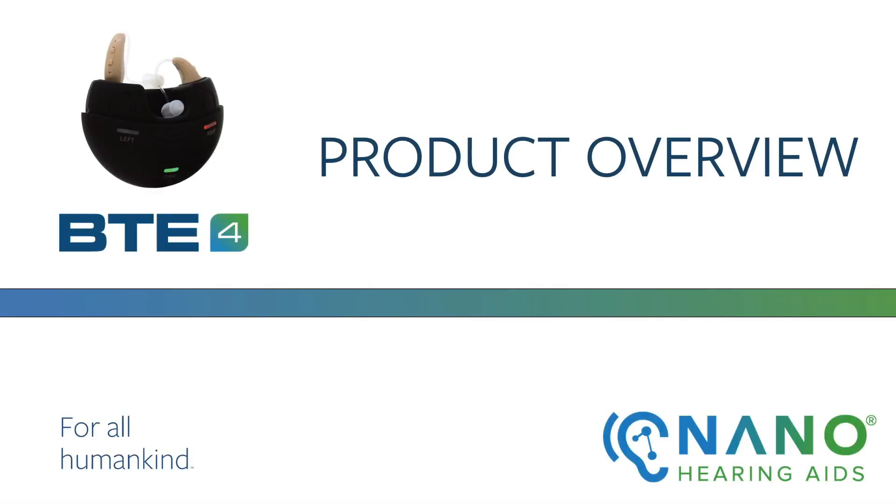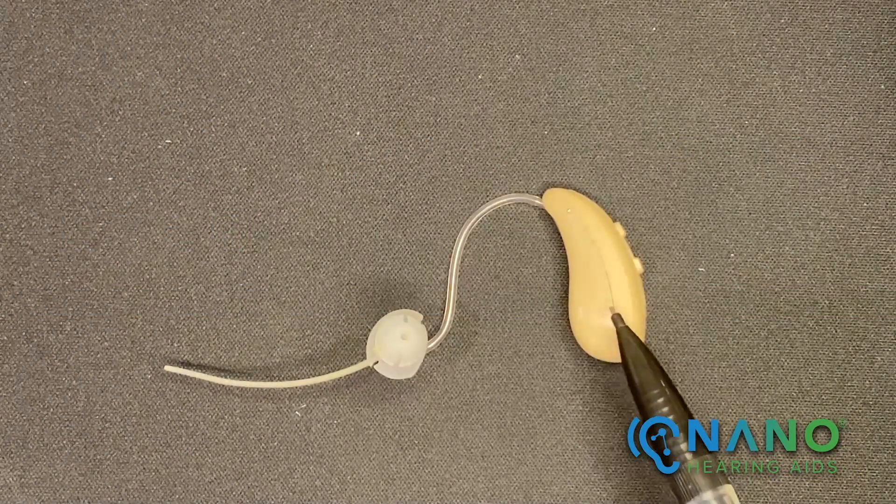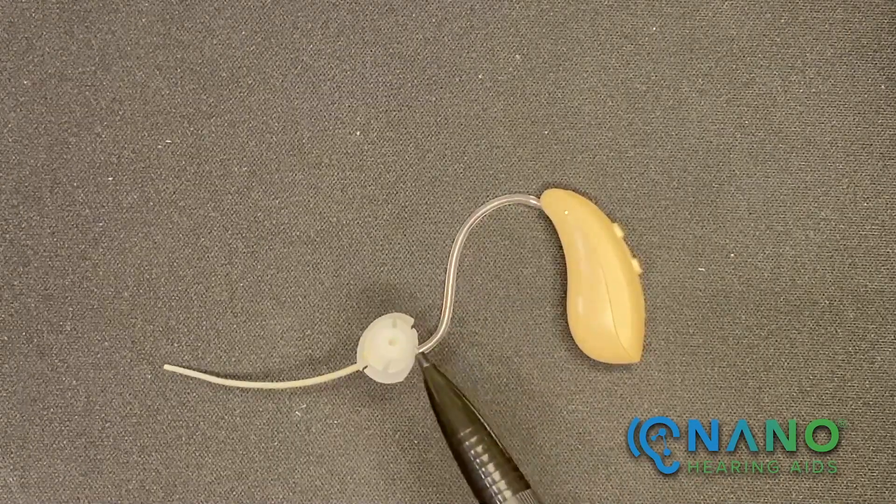This is a tutorial of the Nano BTE-4 overview. We'll be reviewing the three components of the hearing aid: the hearing aid itself, the thin tube, and the dome.